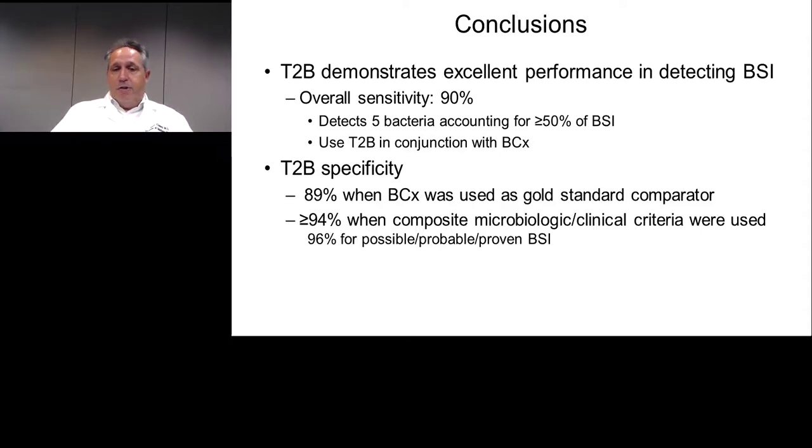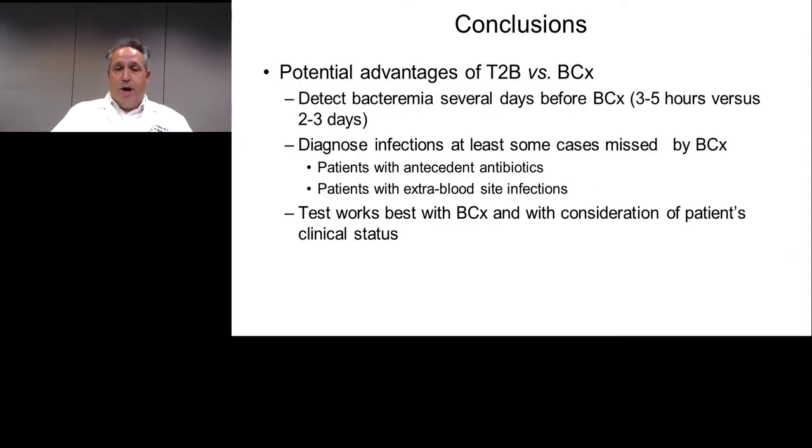The potential advantages for T2 bacteria, as for T2Candida, are rapid turnaround time and the fact that you will diagnose at least some infections that are missed now by blood culture. And in particular, you're going to have superior performance among patients who are already receiving antimicrobial agents.